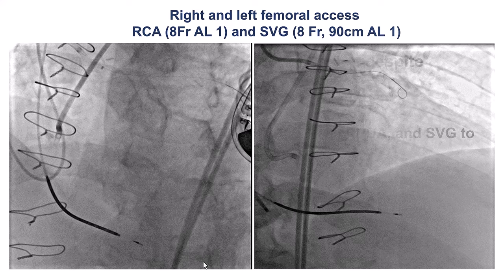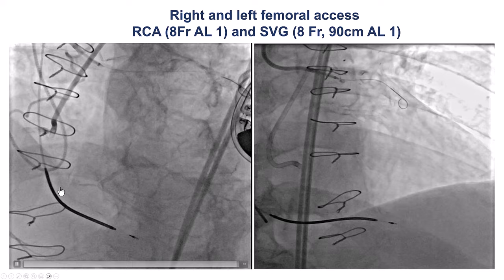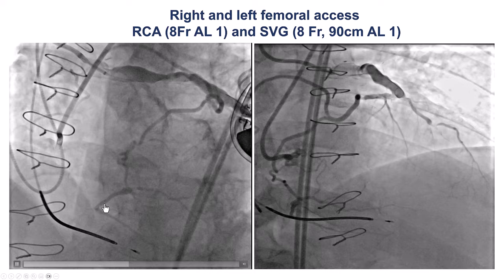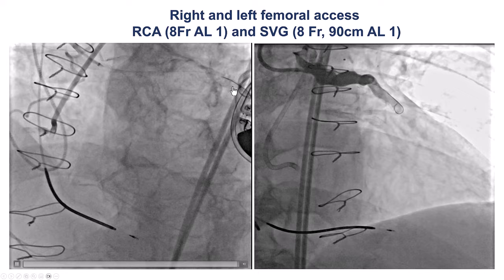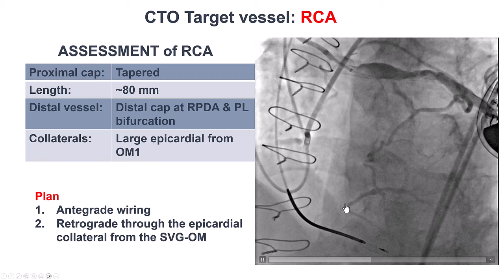Dual injection showed an occlusion of the proximal right coronary that had significant calcification and a tapered entry, and long occlusion length. There is a small segment of the distal RCA before the bifurcation of the PDA-PLV, and a large epicardial collateral coming from the obtuse marginal filling the distal vessel. Clear proximal cap tapered, but long occlusion length, with a bifurcation close to the distal cap and an epicardial collateral.